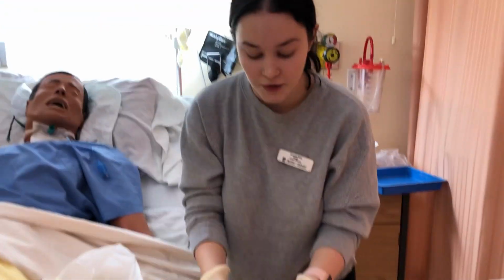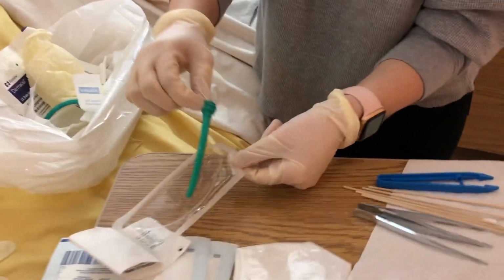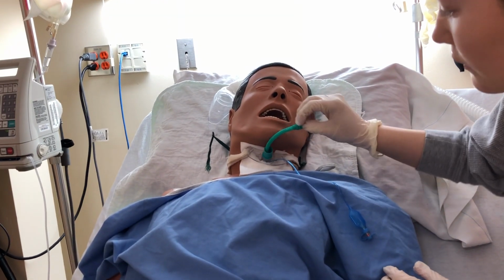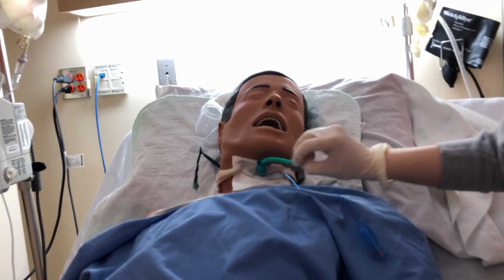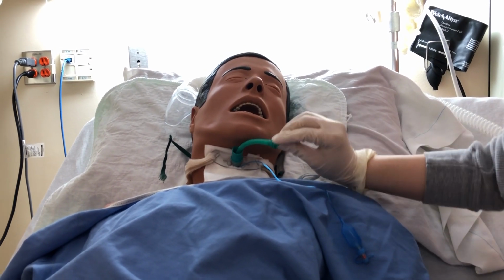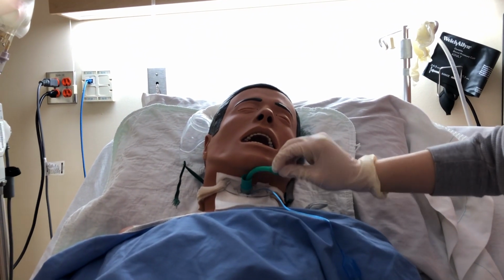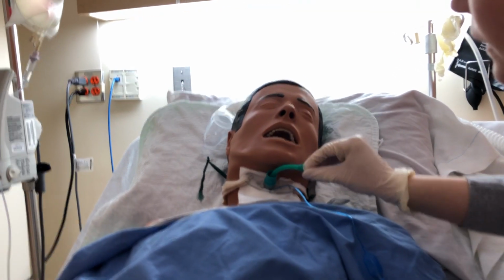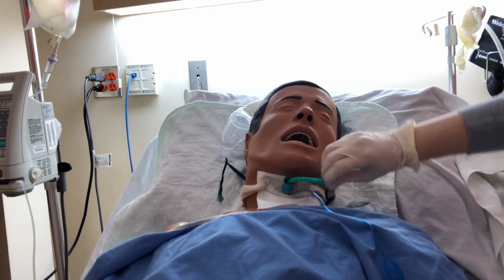And I'm only touching the inner cannula at just this top portion, keeping everything else sterile and coming in from an angle.